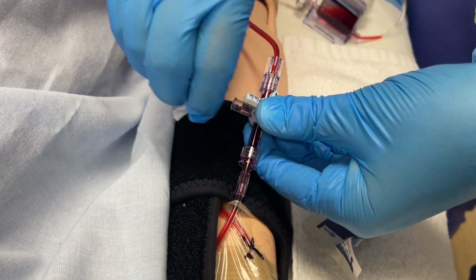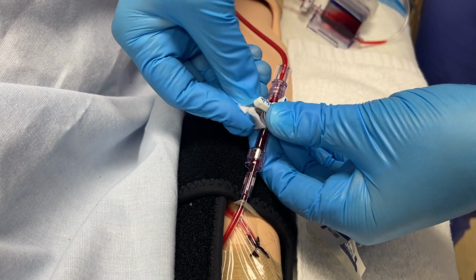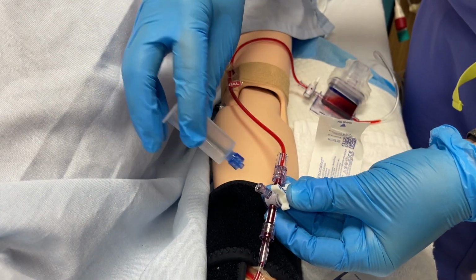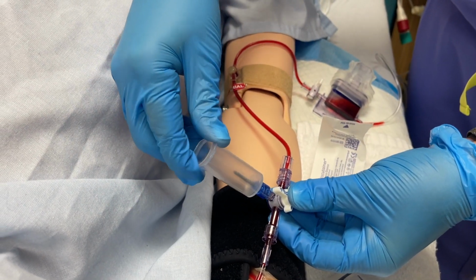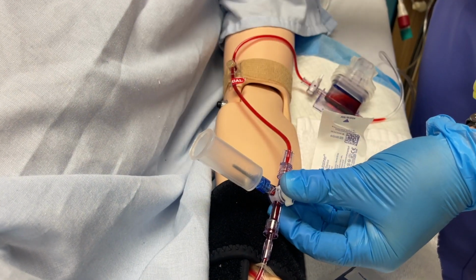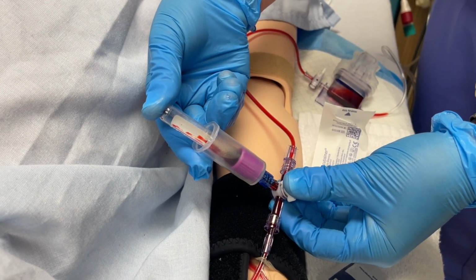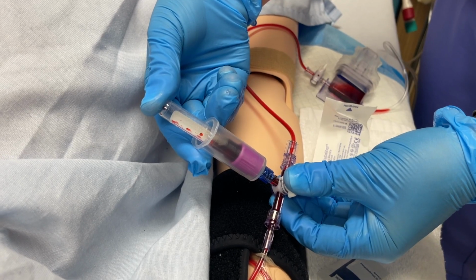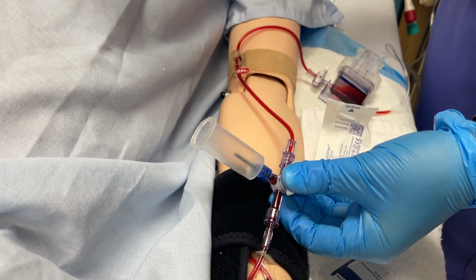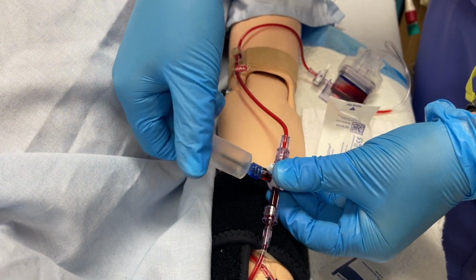Keeping the lever pointed off to the air, we'll start by cleaning our port. Then we will attach the Luer connector tube transfer device for specimen collection. We will then turn the stopcock off to the line setup and away from the access site. Pop on your tubes using the respective order of draw, inverting them as appropriate like before. Once all tubes are collected, you may turn the stopcock back off to the air.